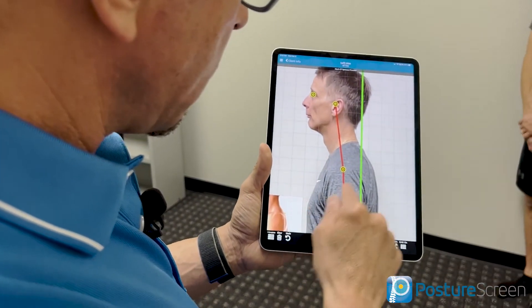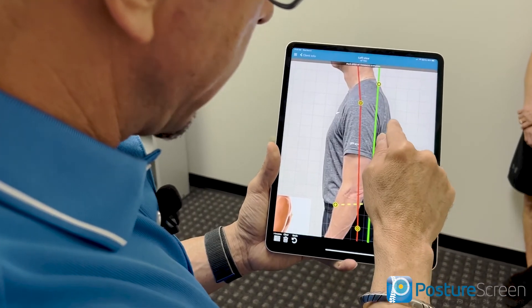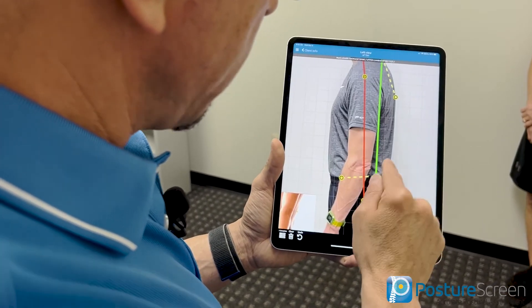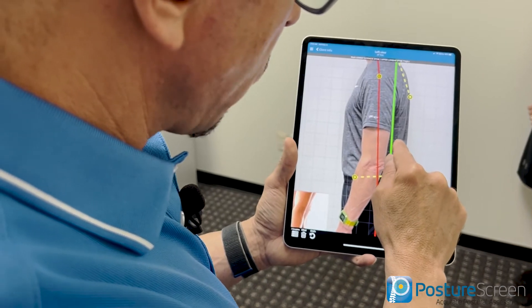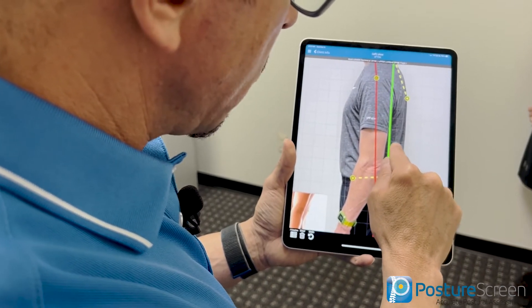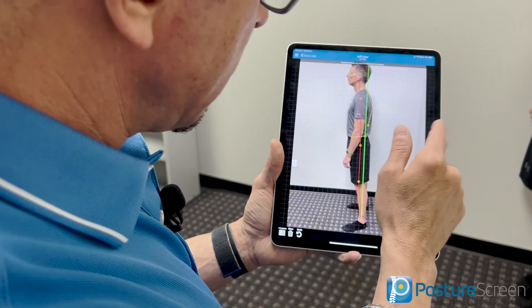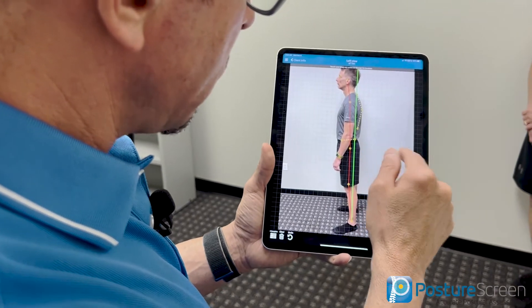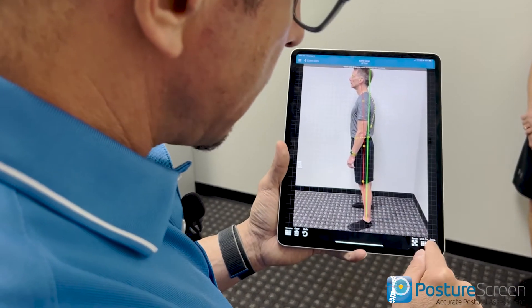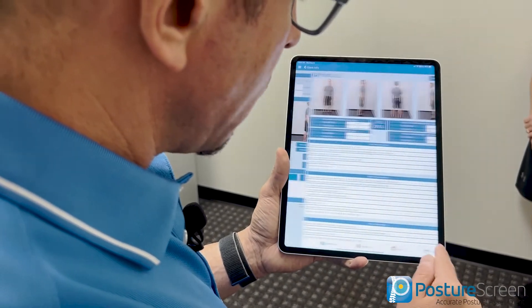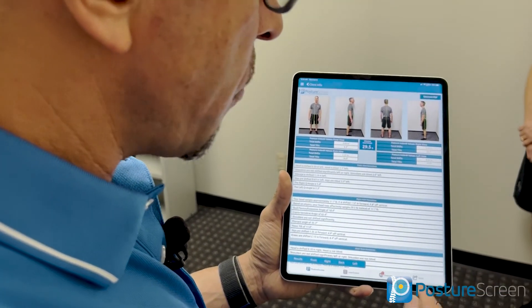For the other lateral view, do the same thing: C7 spinous approximation, apex of thoracic kyphosis, follow the body margins down to just above elbow level, double-check PSIS-to-ASIS, correct any points if needed, and hit Next. Now I'm done with all four views.